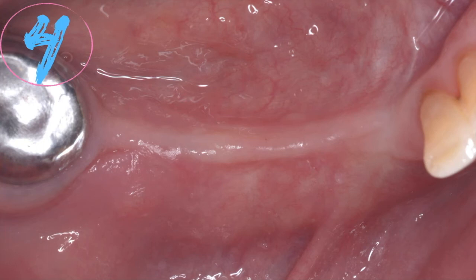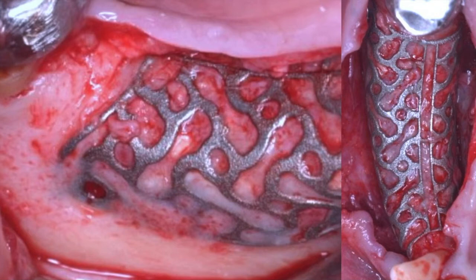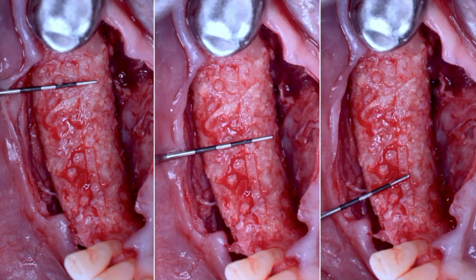We now enter the fourth phase. The beautiful soft tissue healing allows us to easily elevate a full-thickness flap to expose the membrane. We can see how bone has grown into the membrane, how corticalized the newly formed bone is due to the rich blood supply from the flap, and how the membrane is completely integrated with the bone and the newly formed bone is fully integrated with the native bone. The membrane is removed completely and easily thanks to the opening on the crestal side.